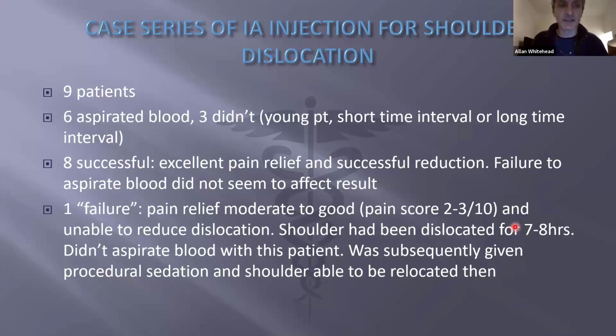But there was one failure out of the 9, in inverted commas. This patient had pretty good pain relief. I might even be scoring myself a bit harshly saying moderate to good pain relief. It was quite mild, 2 or 3 out of 10 at worst, probably more like 1 to 2 out of 10. It was very comfortable at rest. It was just doing the procedure.